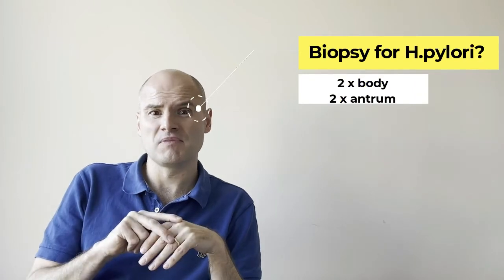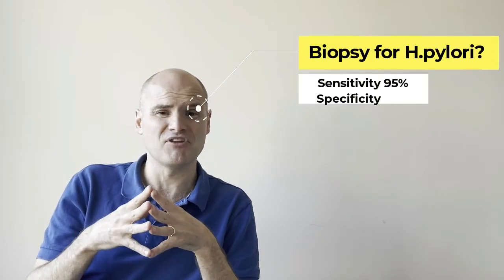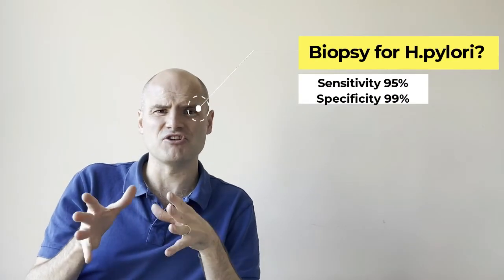So then we need to talk about Helicobacter pylori and how to diagnose it. In terms of invasive testing, and by that I mean endoscopic testing for Helicobacter pylori, it's been long thought that the histopathological diagnosis of Helicobacter pylori was the gold standard. In order to do that, if you are going down the histology route of diagnosing Helicobacter, you need to take two biopsies from the antrum and two biopsies from the body. This increases your yield and also reflects the fact that the population of Helicobacter is not in one place. It will move around and is varied and of course in different densities. Generally speaking, they use H&E staining, but they can also do further staining. Now the sensitivity and specificity for this is very high. Sensitivity above 95%, specificity above 99%. So this is very good.